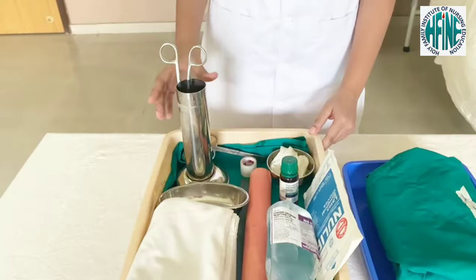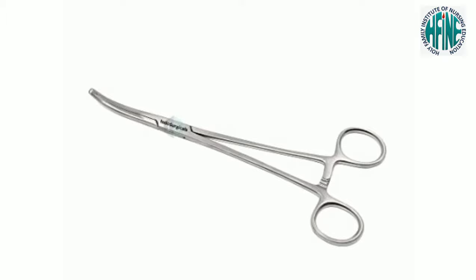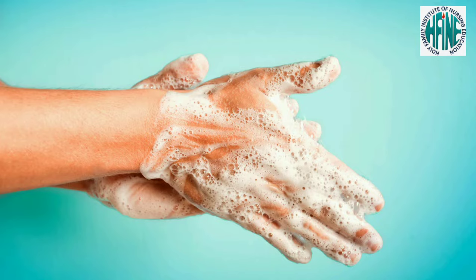A sterile tray containing: artery forceps, thumb forceps, swabs, three bowls, and kidney tray. Wash hands and don gloves.